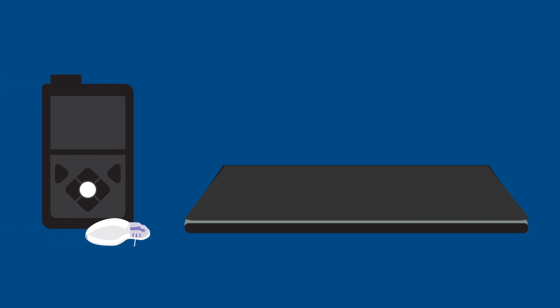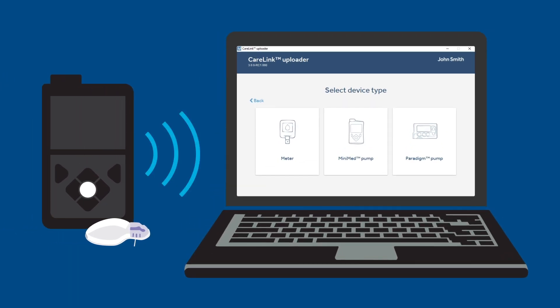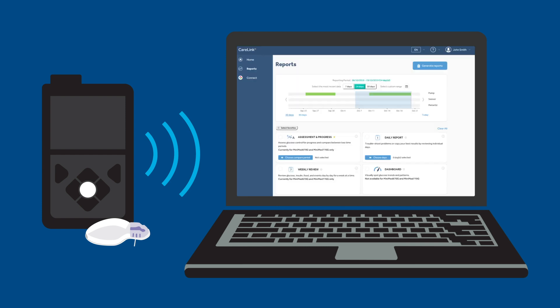CareLink software is a web-based tool that stores information from your insulin pump, continuous glucose monitor, and blood glucose meter, and displays this data as charts and graphs.